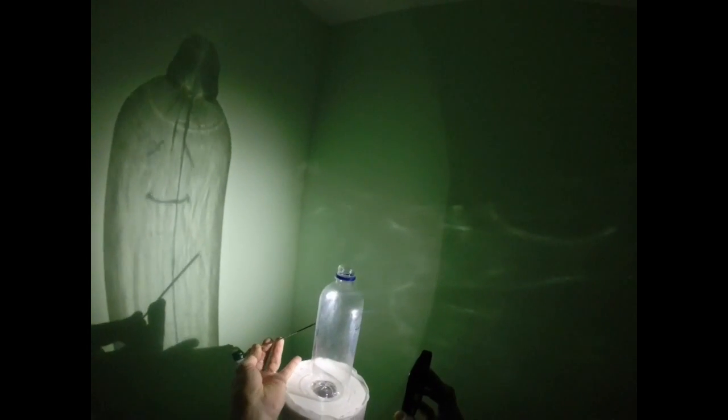Now we are going to go through three different situations. Situation number one: my needle approaching the midline. Number two: it goes away from the midline on the side of needle placement. And situation number three: it goes away from the midline on the opposite side.